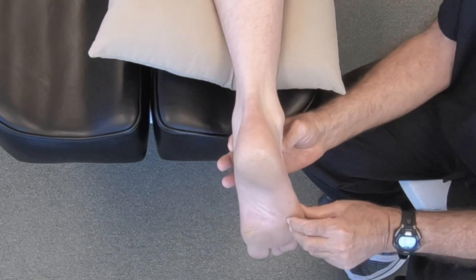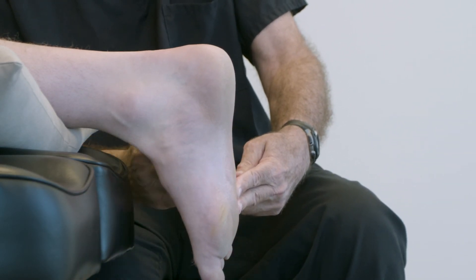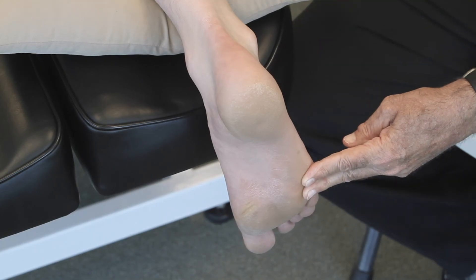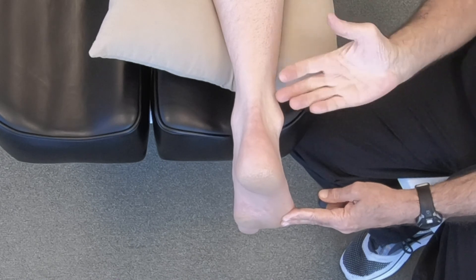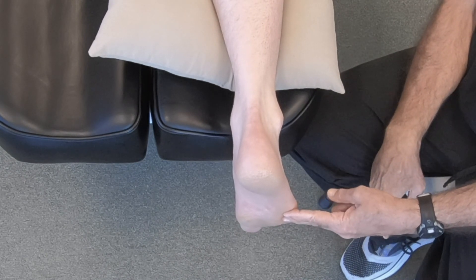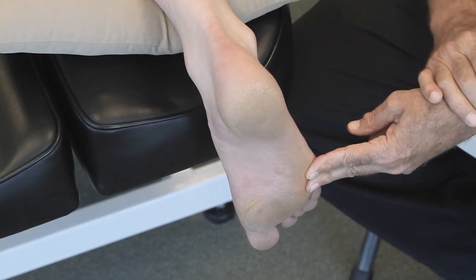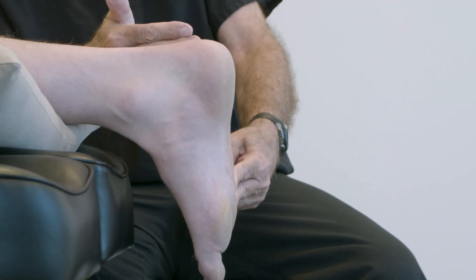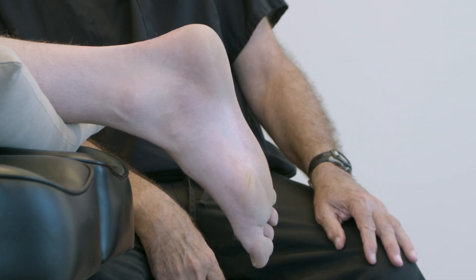We have the patient totally relax, palpate subtalar neutral, then push up on the 4th and 5th metatarsals, which effectively loads and locks the mid-tarsal joint and also dorsiflexes the ankle. An assistant can then take the scan from all angles, or if you're still using fiberglass or plaster, you apply the material holding the foot against metatarsals 4 and 5, keeping it in subtalar neutral with the mid-tarsal joint fully pronated and locked. This is the ideal position for casting or scanning for a custom foot orthosis or a custom Ritchie brace — much different from a relaxed hanging position, which will be not optimal and will likely result in a failure in terms of the treatment outcome.